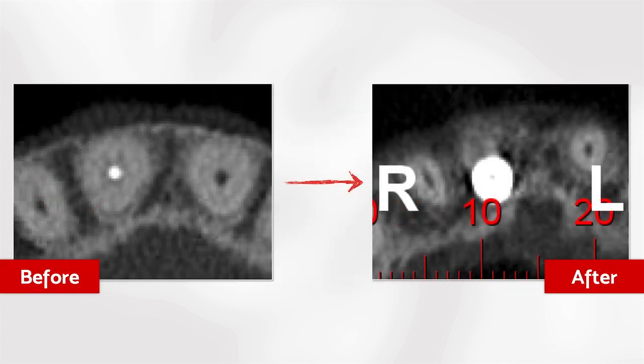This is before and after our planning, and after the execution, the implant was placed exactly in the place that it was planned before, and the gap was respected. 3 millimeters of gap plus 4 millimeters of implant diameter. Take a look at the main difference between the crestal bone thickness before and after this procedure was applied. We have 3 or 4 times thicker than the beginning.